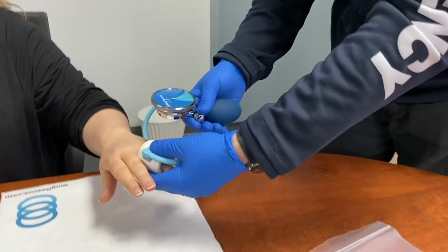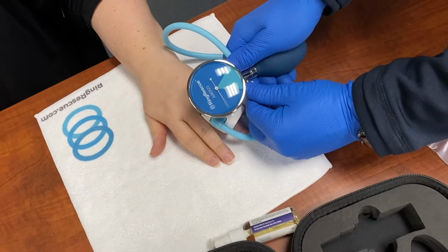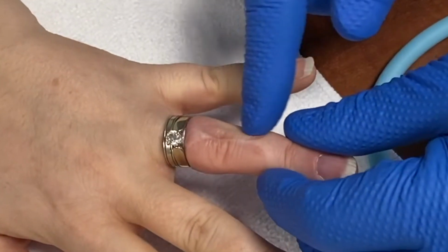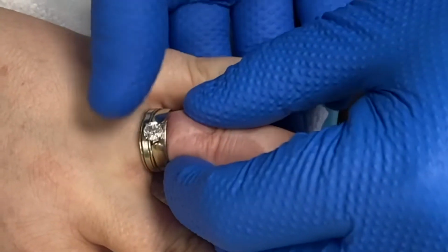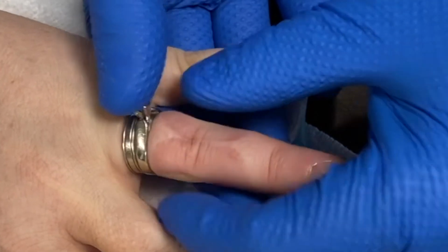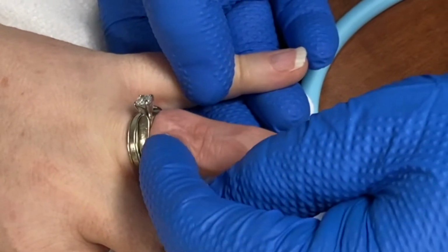Okay, so the second round of 5-minute compression is done. So we're going to open this valve here to let the pressure off. We're going to remove the cuff, and you can see it's really shrunken down a lot there, which is awesome. I think we're going to be probably set up for success here. I feel like right through here, it's perfect. There's still a little bit of a skin bulge here to work with.